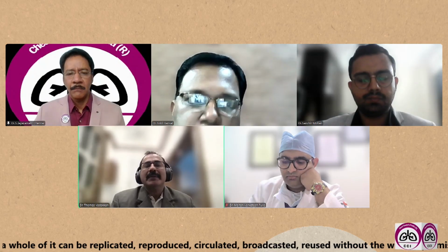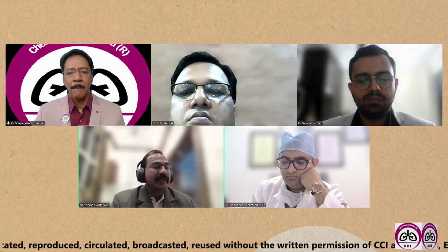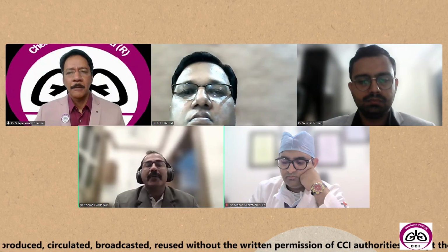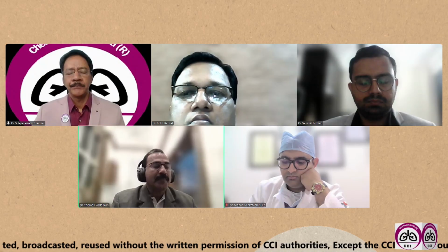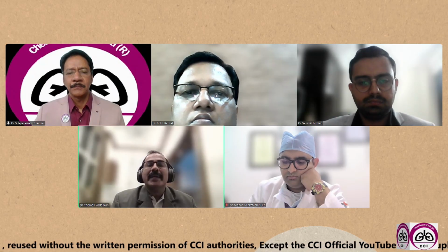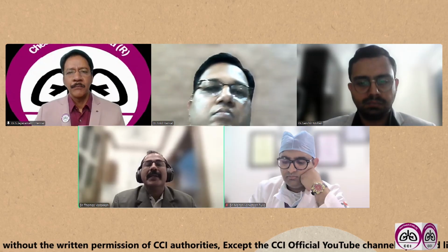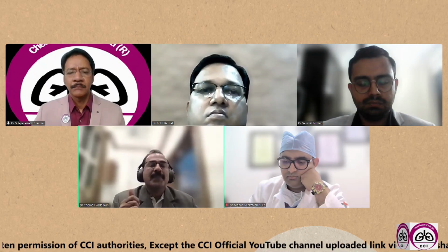But EBUS is also evolving in such a way that these limitations can be addressed, like smarter imaging, especially a thinner convex probe, where you can advance the scope a little beyond the conventional EBUS scope. And we can have elastography, where you can identify benign and malignant nodes and also choose the right area for biopsy.